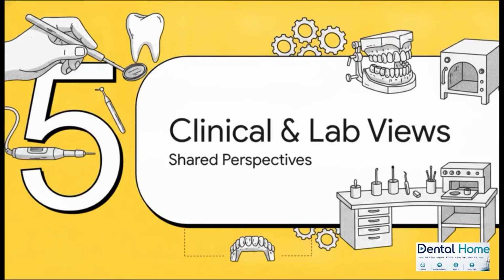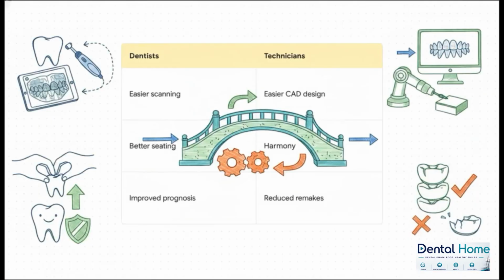Let's wrap up the technical breakdown in Section 5, clinical and laboratory perspectives. And this brilliantly illustrates the harmony that happens when the insertion path is perfected. It acts as a literal bridge, pun totally intended, between the dental clinic and the laboratory. For the dentists, it means easier impressions or digital scanning procedures, far better seating of the final restoration without grinding and adjusting for hours while the patient waits, and a vastly improved long-term prognosis.